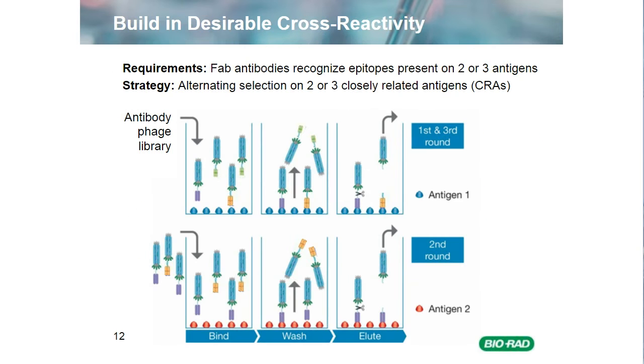So with this slide, I'd like to address the question that was asked a couple of slides ago. Does the antibody bind the target? And if it binds the target, does it bind the target in all of its forms? So let's imagine a scenario where the analyte is a biotherapeutic, and that biotherapeutic might be present in the sample both in the free form and in a target bound form. And it's desirable to generate antibodies which recognize both forms for total pharmacokinetic measurement of the amount of drug in the sample.